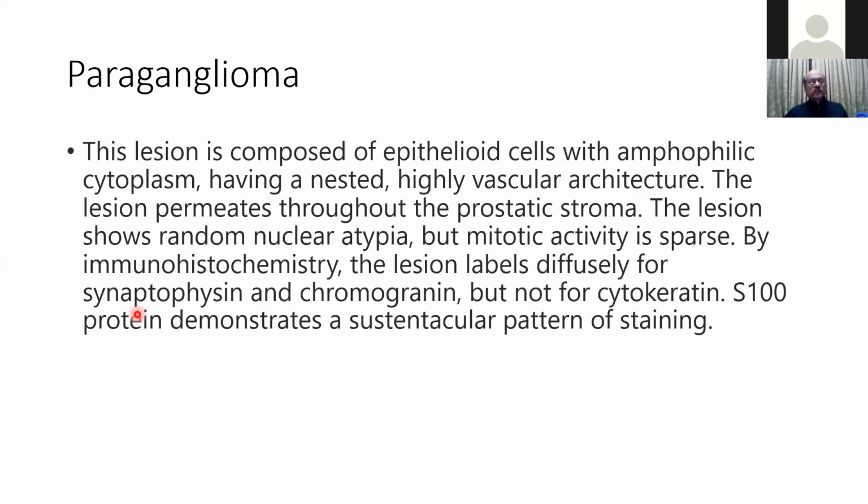They were synaptophysin and chromogranin positive, and cytokeratin was negative. S100 was positive in a sustentacular pattern. So it is paraganglioma.